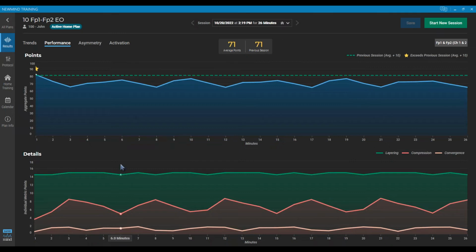Now, Aaron, can I ask you a question on that? Sure, please. On the interesting point about convergence, when both sides, right and left, are lined up together, can you put that in terms of communication between the two hemispheres? Is that a possible word? That might be a question for Dr. Suter, or maybe Rob has some information on how that ties in. It's a great question. Can you repeat it, and I'll see if I can answer it.